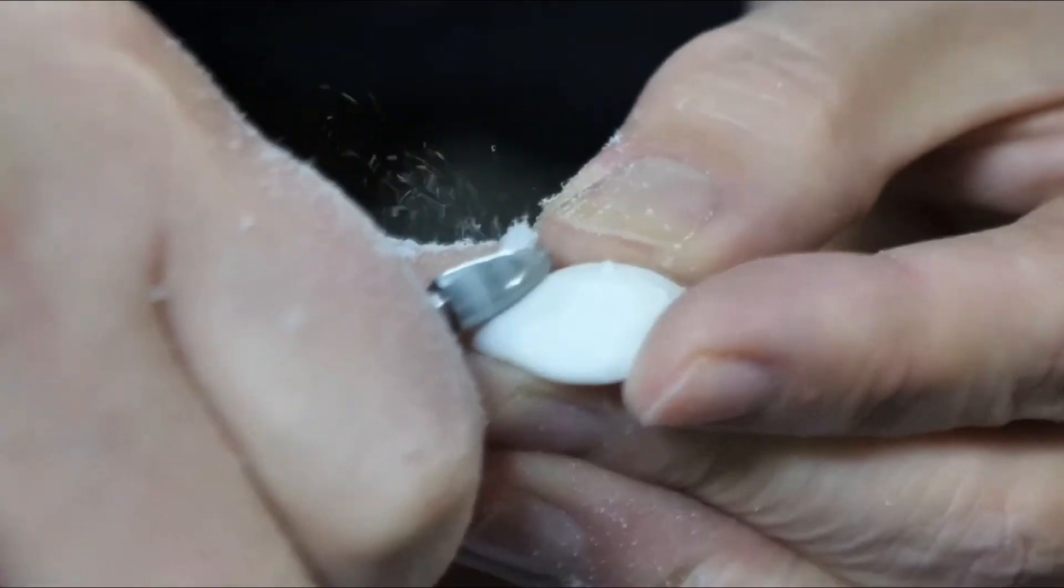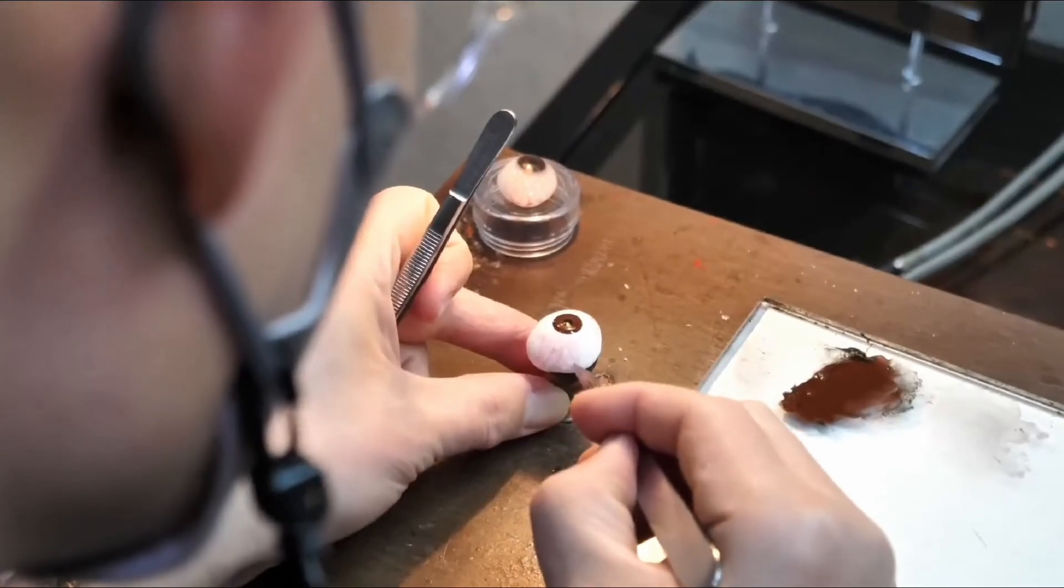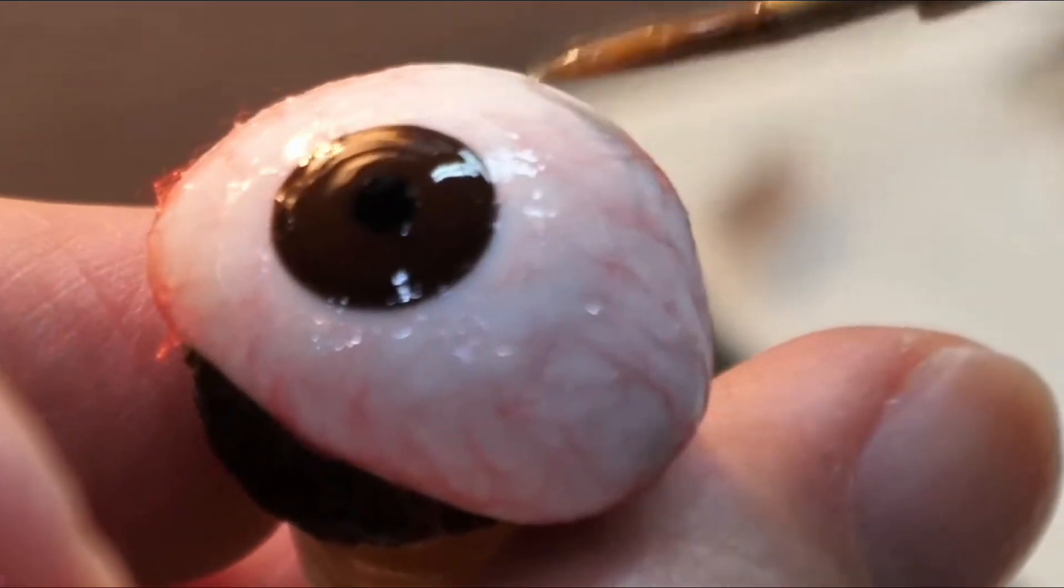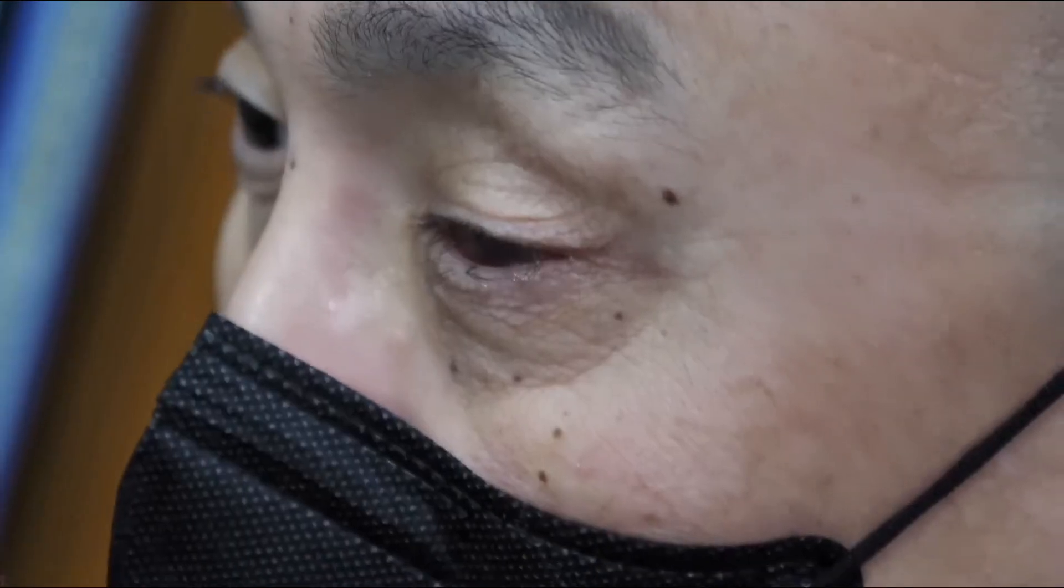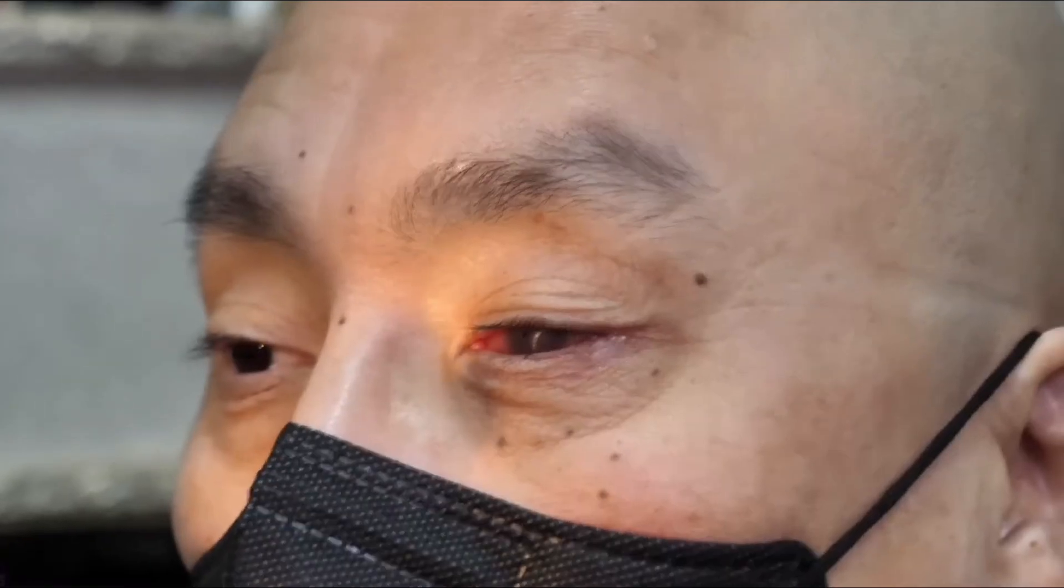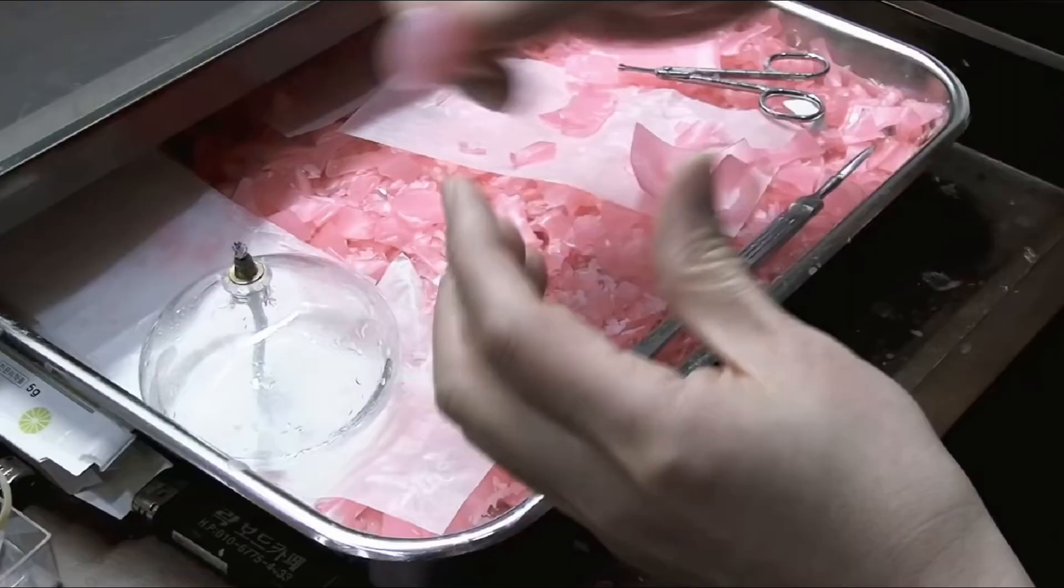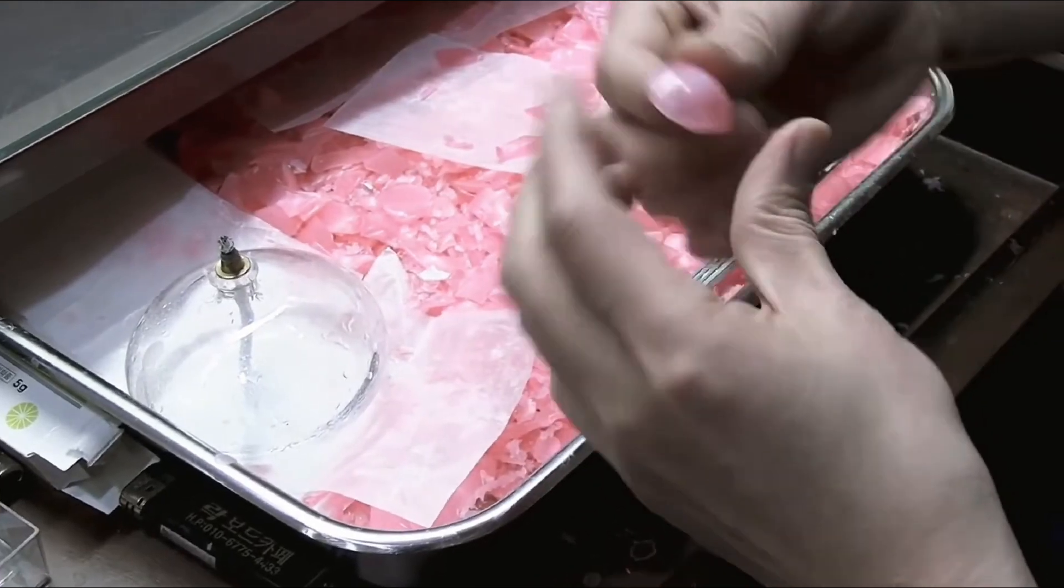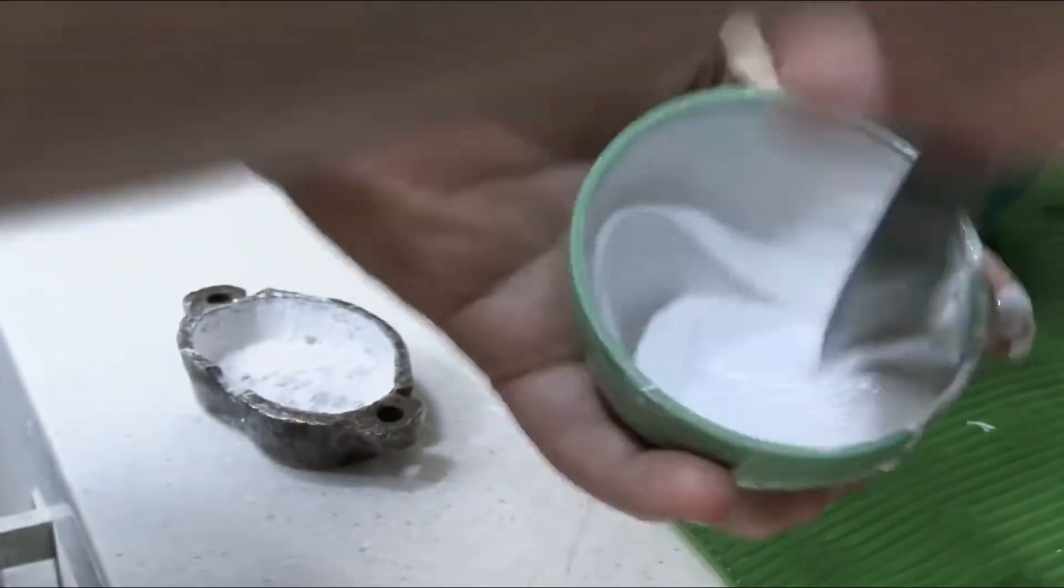The ocular prosthetic process starts with a consultation, where impressions or 3D scans of the eye socket are taken for a perfect fit. Using materials like acrylic or silicone, the ocularist sculpts and paints the prosthetic eye, meticulously recreating the natural eye's color and texture. The final step involves a fitting session to adjust the prosthesis for comfort and mobility. Regular cleaning and maintenance ensure the prosthetic eye remains functional over time.